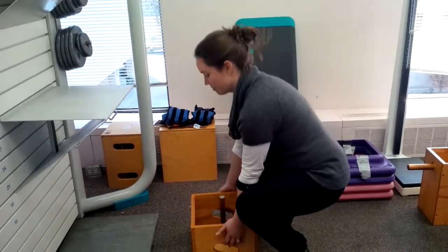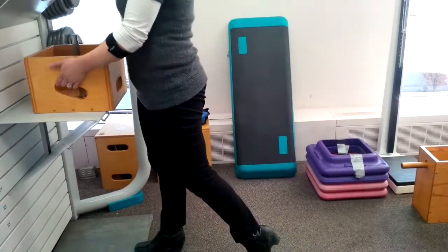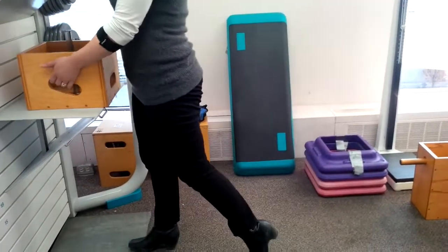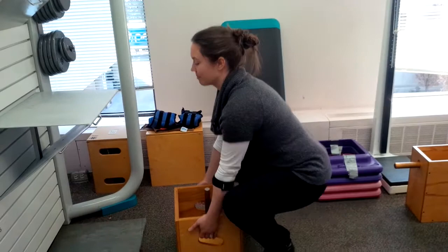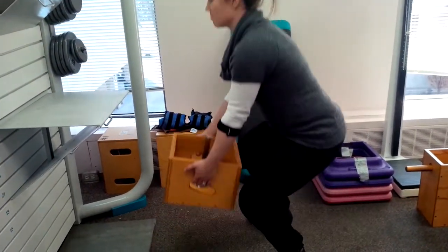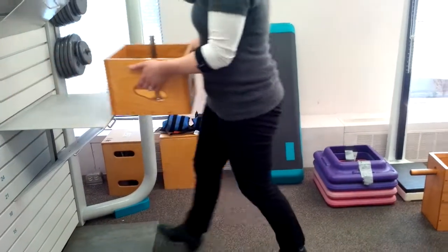Go ahead and do the lifts. So all the way up, back down again. All the way up for number two, and down. All the way up for number three, and sit down. All the way up for number four, and relax.